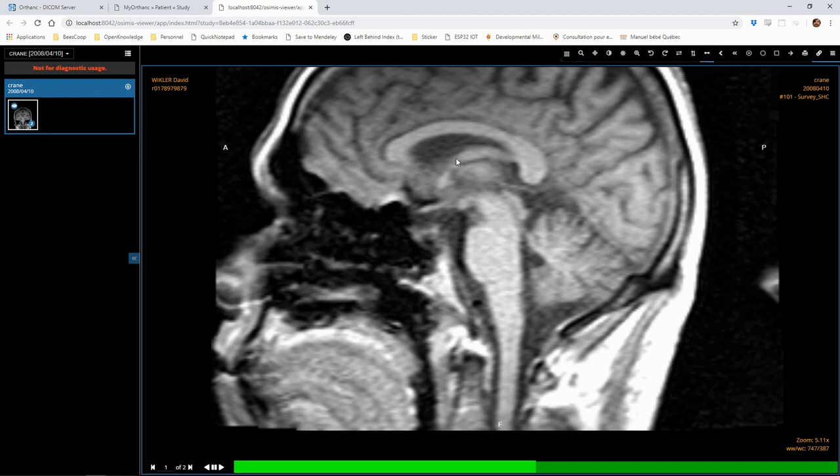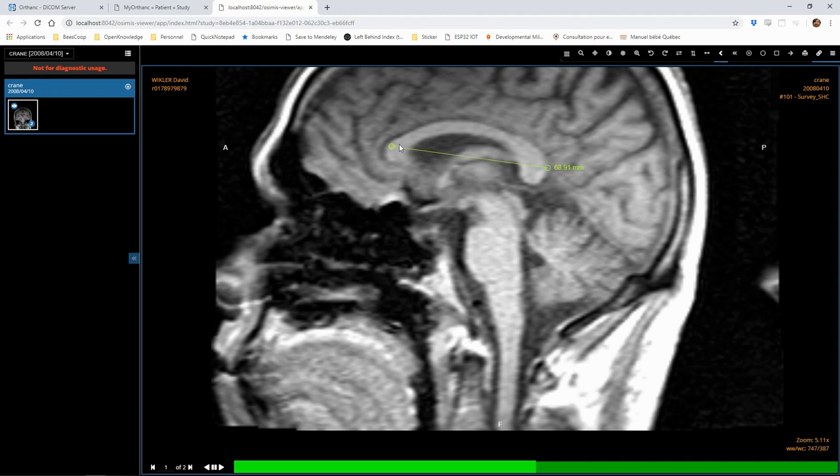We also have some measuring tools which can use the metadata from the DICOM file to compute real distances in millimeters from the distance in pixels.